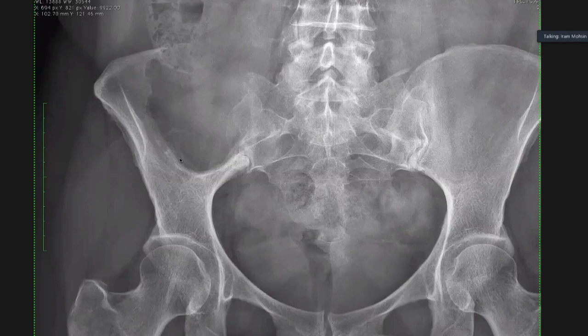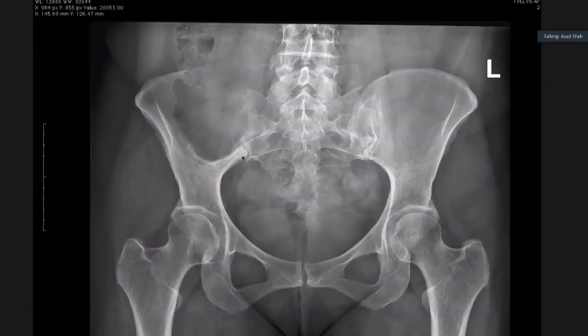And you said RCC or thyroid, sir. So it can be mets from a thyroid. Breast can give you, breast or lung can give you. Right, sir. Fair enough. All right. So, what's the next step then? How can you confirm what it is? So the next investigation should be an MRI examination.